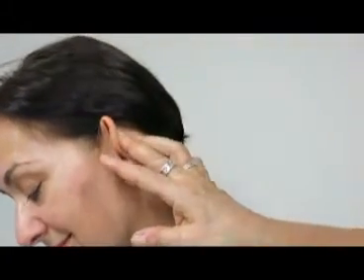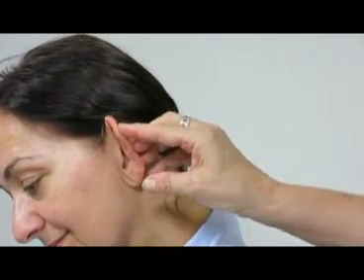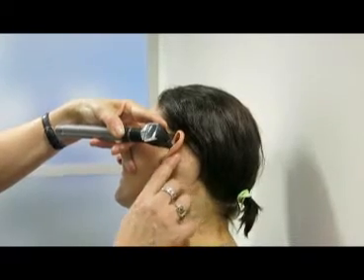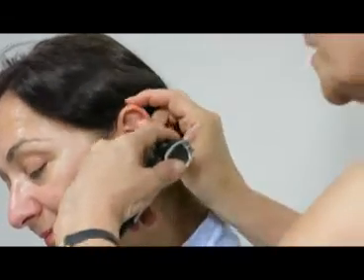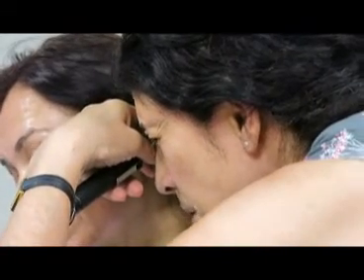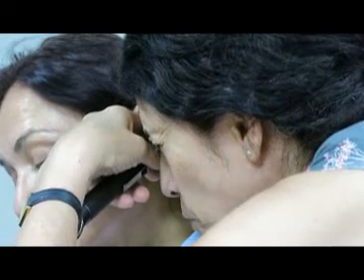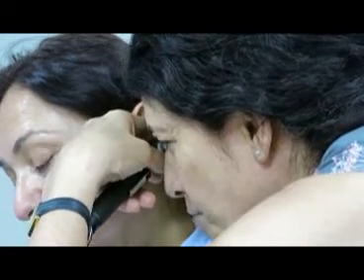The first thing I do before I take an impression is perform otoscopy. I have a look behind your ears to make sure there's never been any operations or mastoidectomies. If that's the case, you're going to have to have an ear, nose, and throat doctor pack her ears before we can take an impression. I've found out she hasn't had any operations, so now I'm going to have a look inside her ears. I want to make sure there has been no infections, no pus, and the ear is looking healthy. I'm also looking to see where the eardrum is positioned so I can put the otoblock in properly and to have full coverage of it.